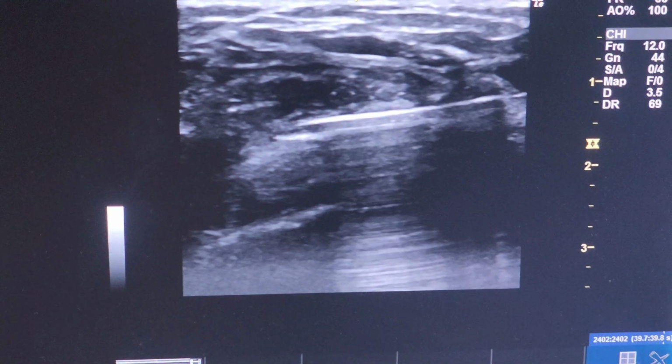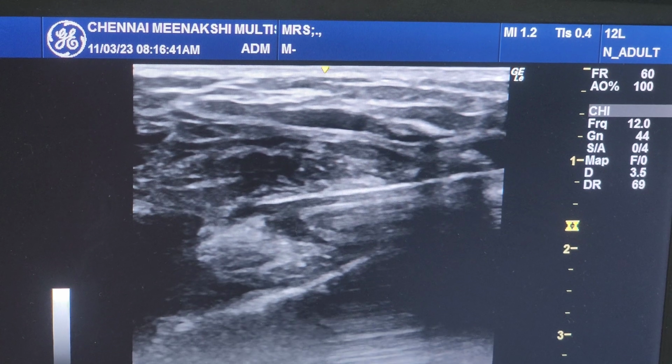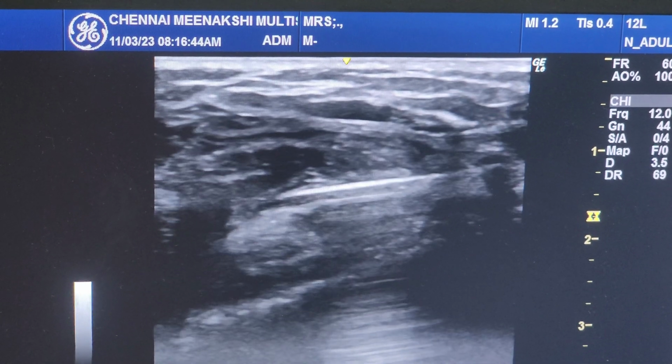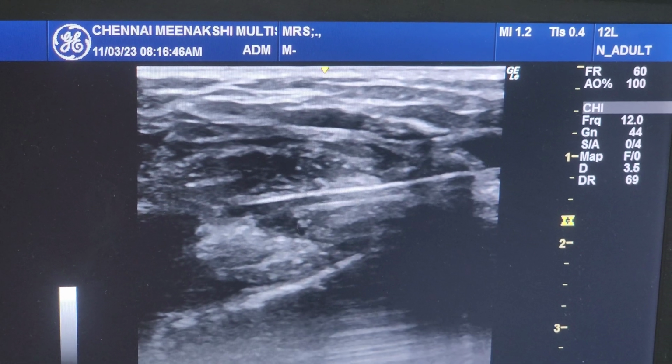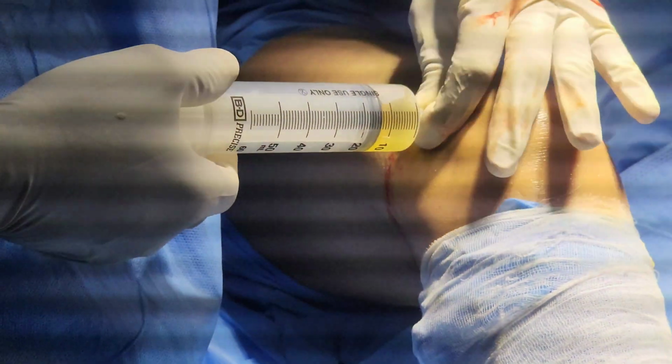The fluid has been drained out. You can see the needle there. All the fluid has been aspirated. The needle is now confidently inside the knee joint. I am removing the ultrasound probe.